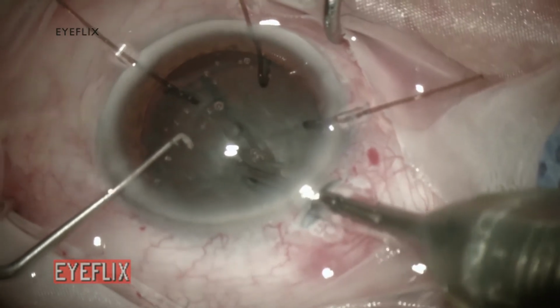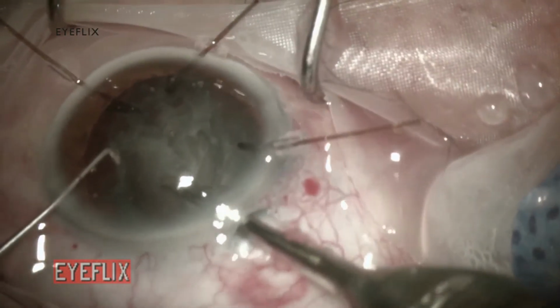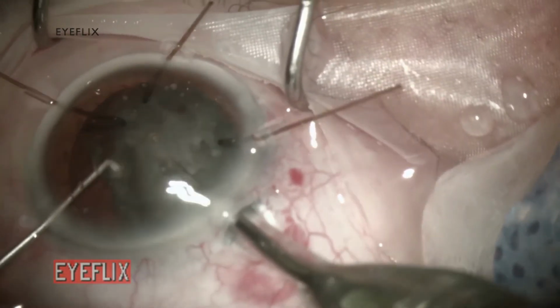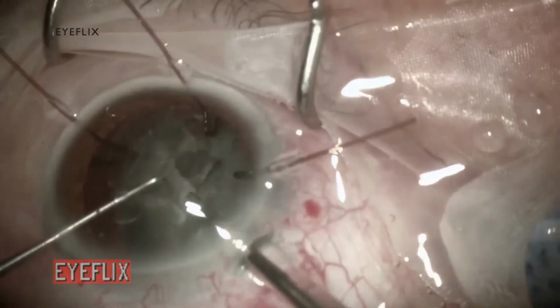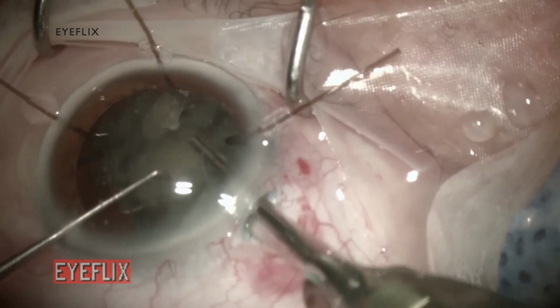I find it easier to start with the heminucleus where the zonule is stronger, thus allowing the other heminucleus to maintain the bag formed where the zonule is absent. Working outside the bag diminishes the chances of posterior capsule rupture in a case of zonular weakness.